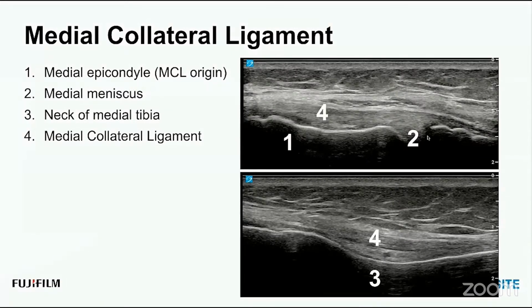All right, so medial epicondyle, high, easy to see bony landmark, cortical shadowing here. We see the medial joint line, and then here's the medial tibia. So we're on a coronal scan plane. And then this MCL, if you had a chance to look at the elbow webinar that we did, this looks a lot like the UCL in the elbow. It's got this huge kind of bugle, sail-shaped looking ligament fibers going across this medial epicondyle, which coincidentally is the same as the medial epicondyle of the elbow.